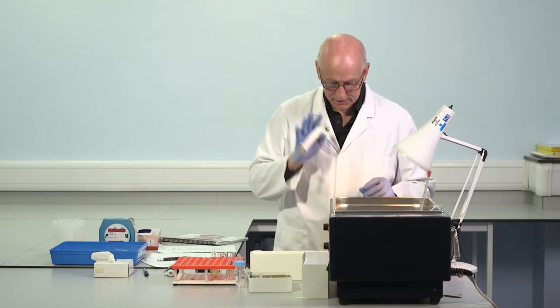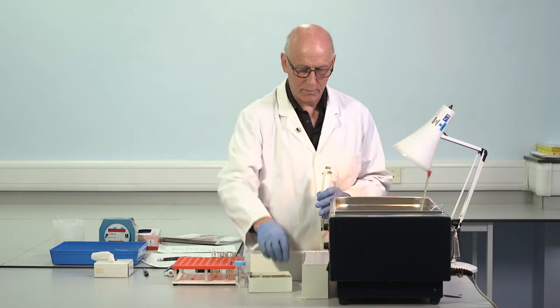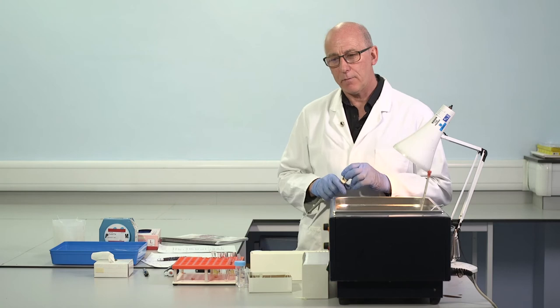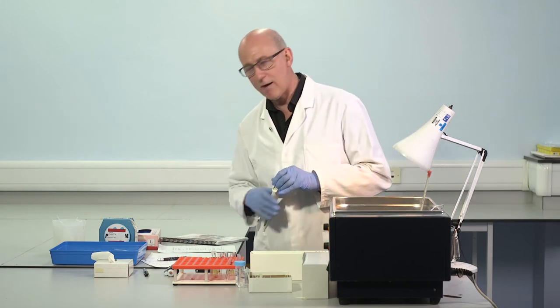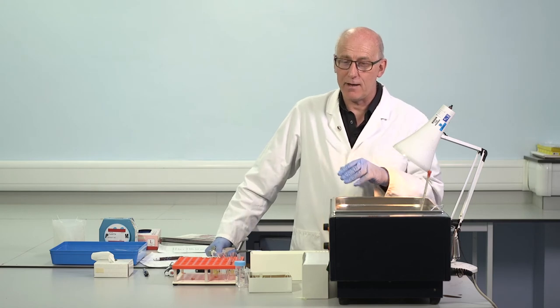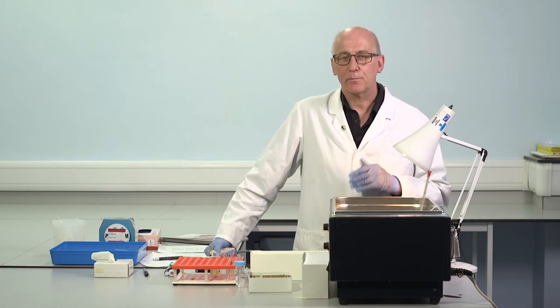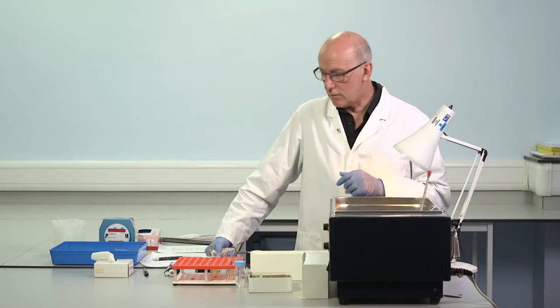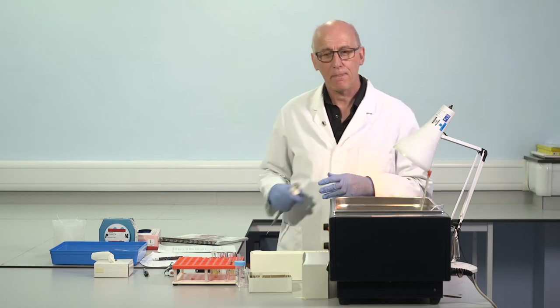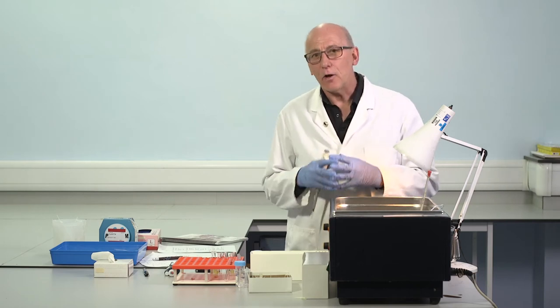So this is an immediate mix. We'll come back to that point in a moment. Just warming up. Now if you remember, patient number one had an APTT of around 48 seconds. Upper limit of normal, 38, 39 for this method. So it's prolonged. It's not dramatically prolonged in the same way that some of the others are. And we can draw some conclusions from that.